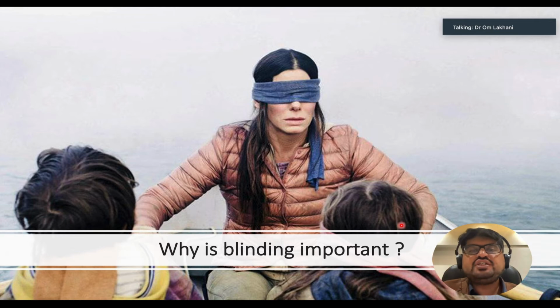So using a professional CGM once in a while blinds the patient, and you know about clinical trials, right? What do clinical trials do? They have a blinding process where the investigator and the subject are not aware of what's going on. The same way, consider a blinded CGM like an RCT. Both the investigator, me, and the patient are not aware of what's really going on. But when the patient comes back to us, you get the data, then you sit with the patient, you analyze the data, and you find the problems, and then you deal with the problems, right?